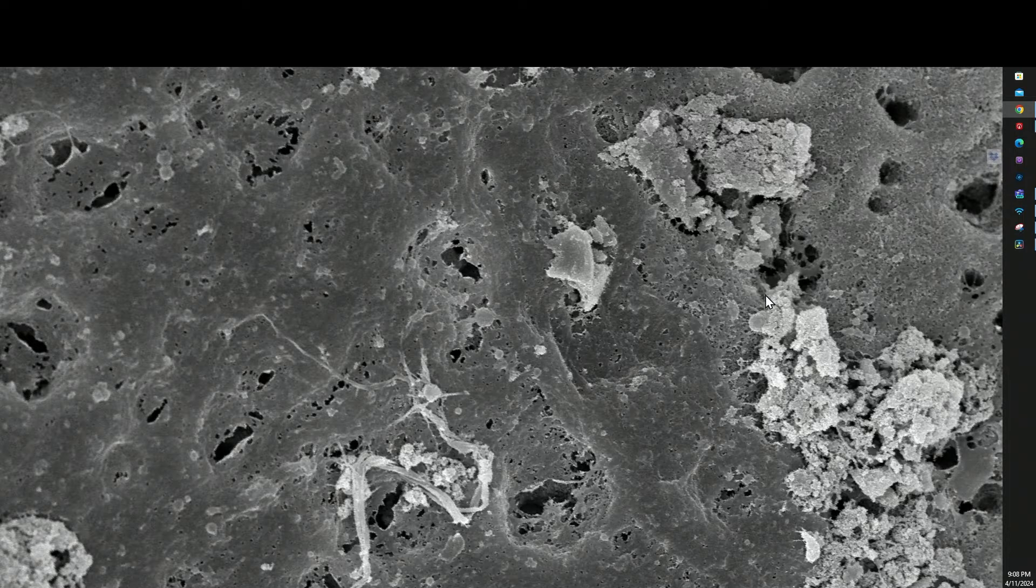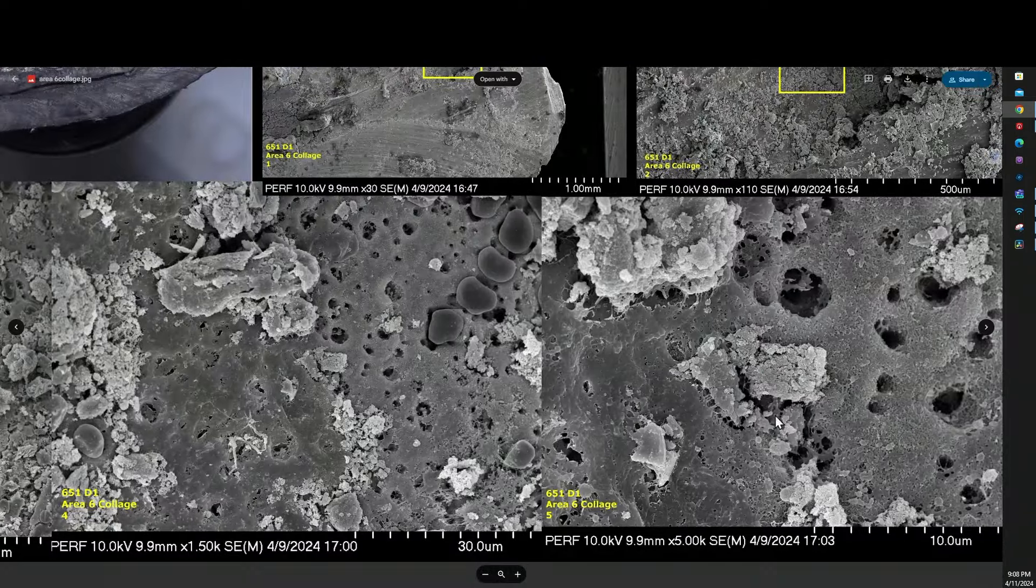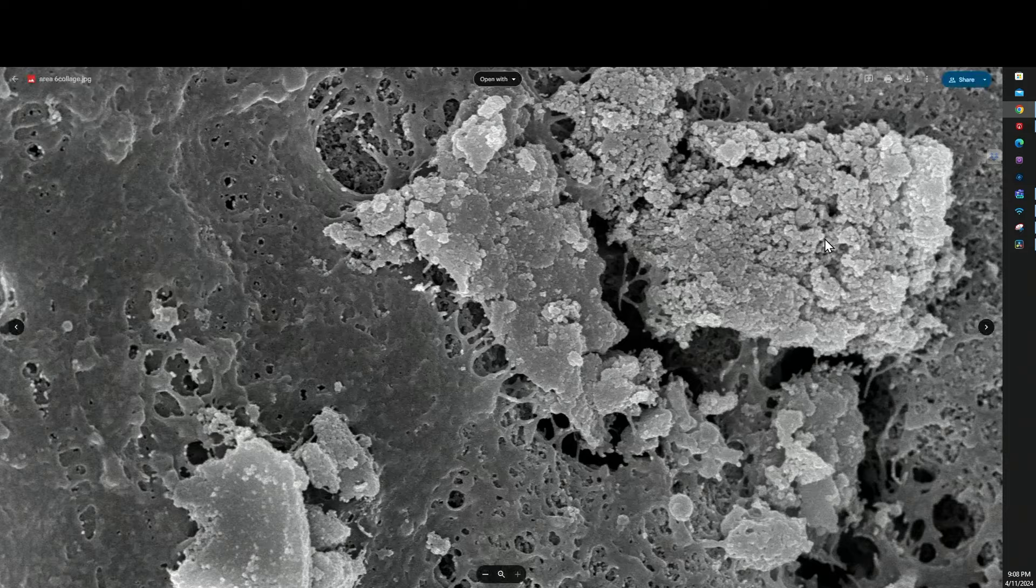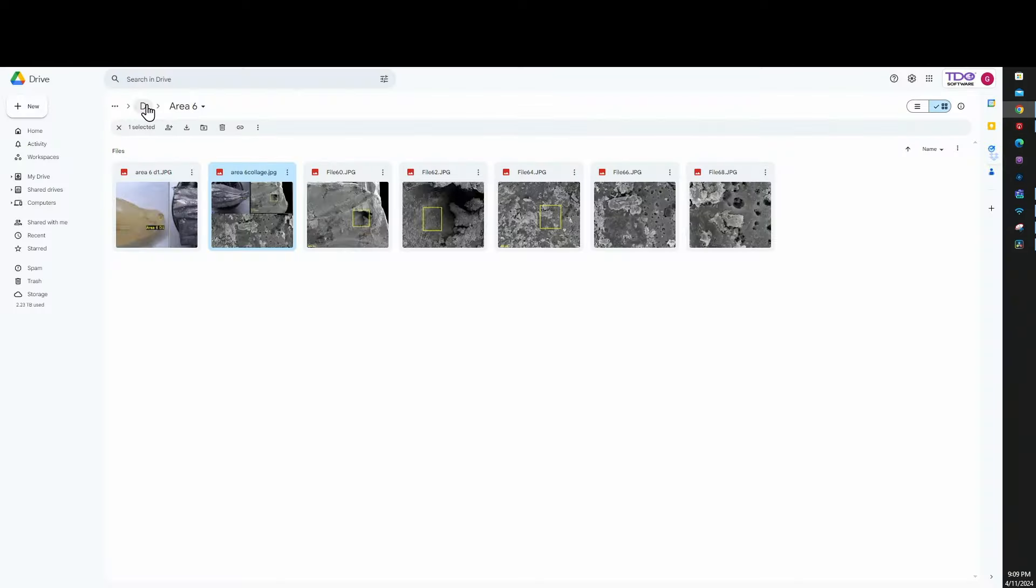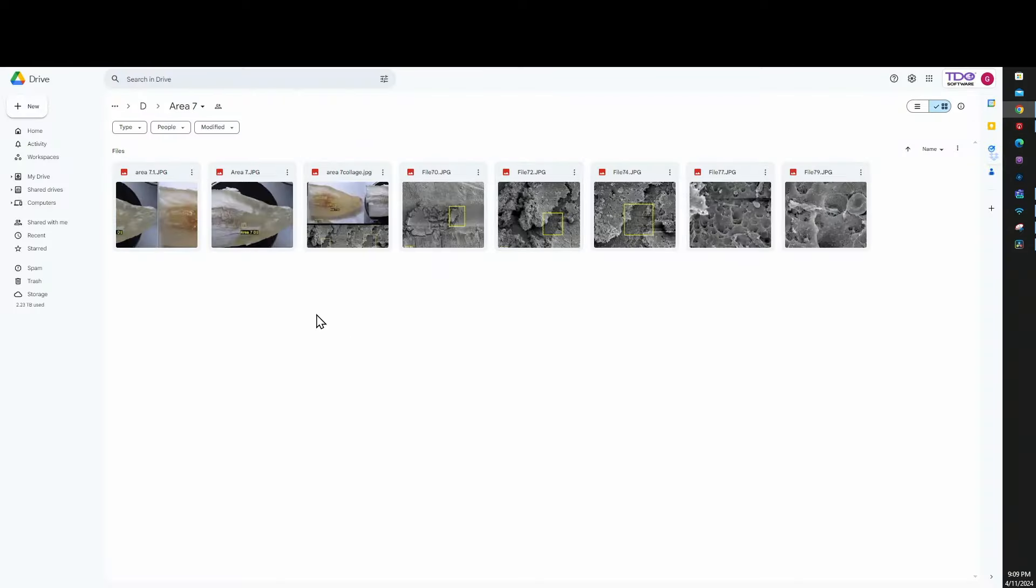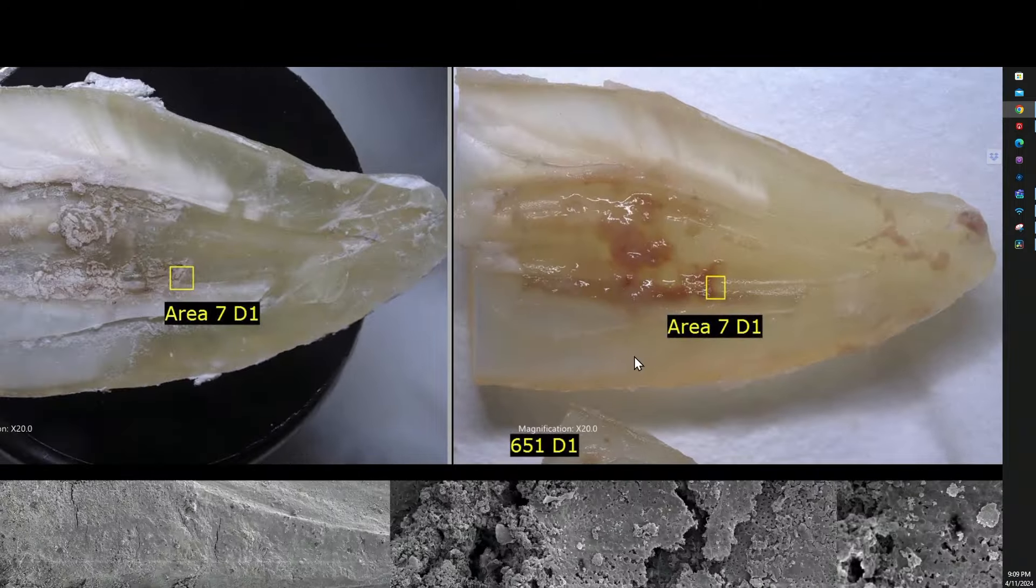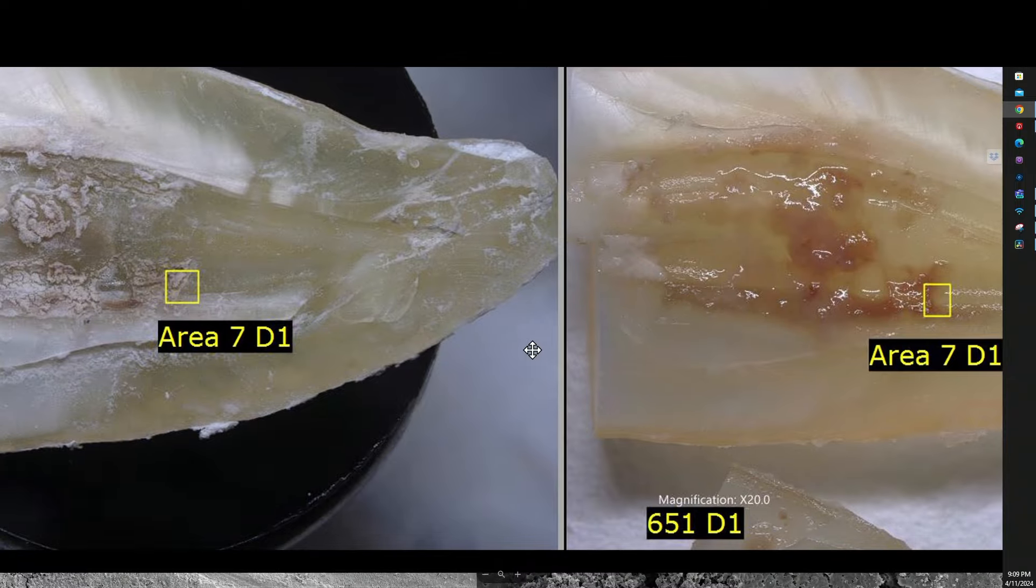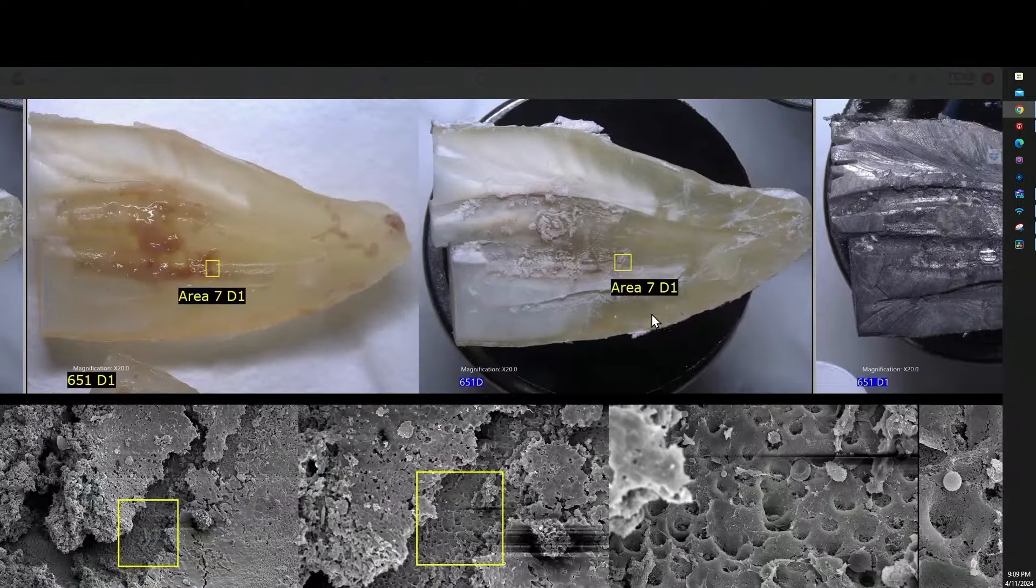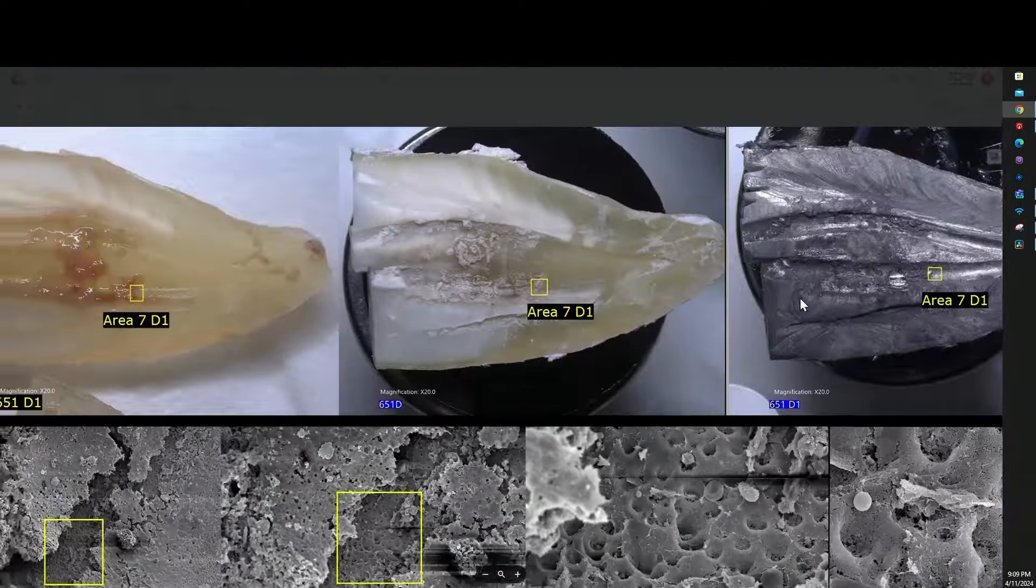You see areas where the pre-dentin has been pretty much removed and other areas where it hasn't been completely removed. And you'll see evidence of some dentinal tubules that have been fairly well demineralized. This is an area further up near where the soft tissue was.